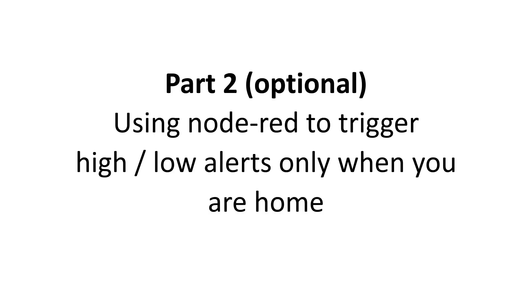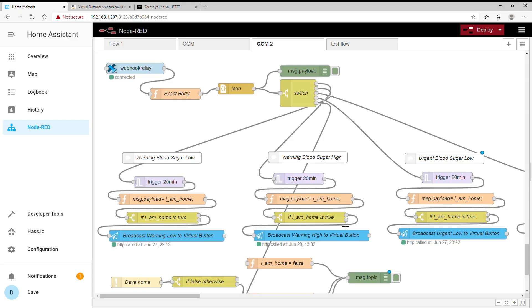This next part is optional — if you're happy with the setup you can stop here. This is an extra step where I make the alerts only trigger if I'm home. If I leave, the Alexa alerts won't go off. What bugs me is if I leave my flat and someone else is home, all my Alexas will keep broadcasting urgent and warning alerts even though I'm not there, which is annoying.